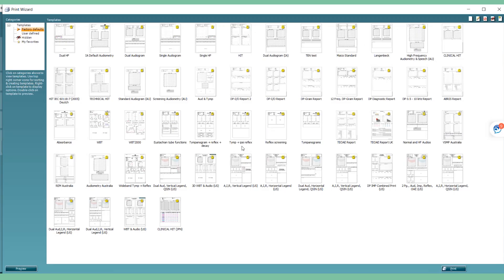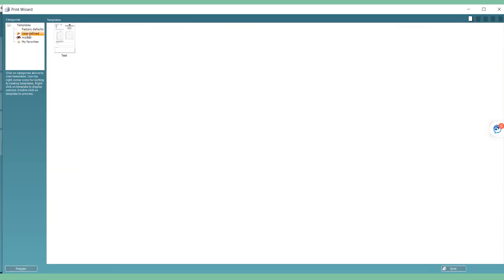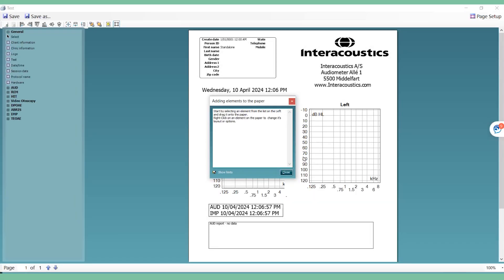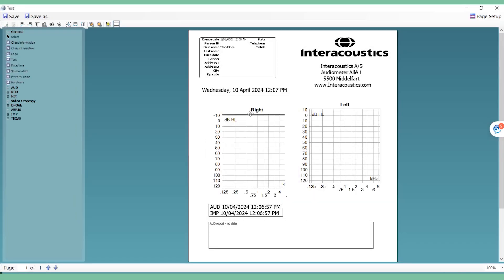Now, under the User Defined tab, you will see your recently created print layout. If you wish to edit this, select it and click Edit Template. This personalized template will now always be available under the User Defined section.